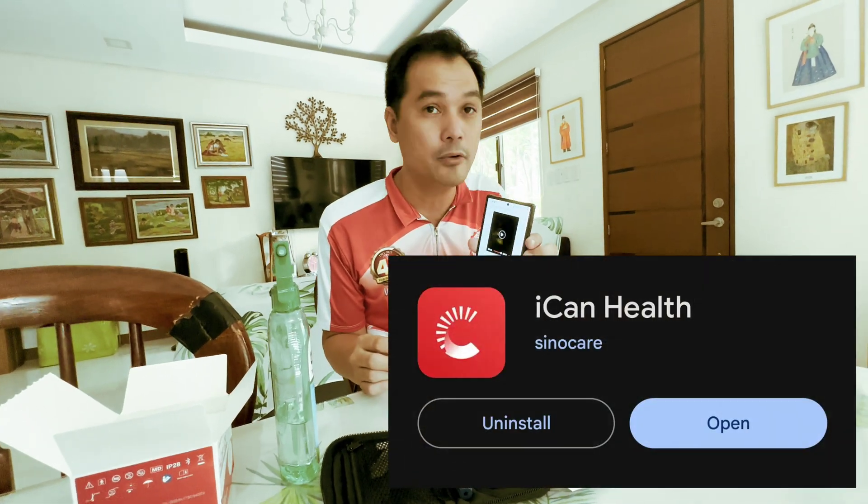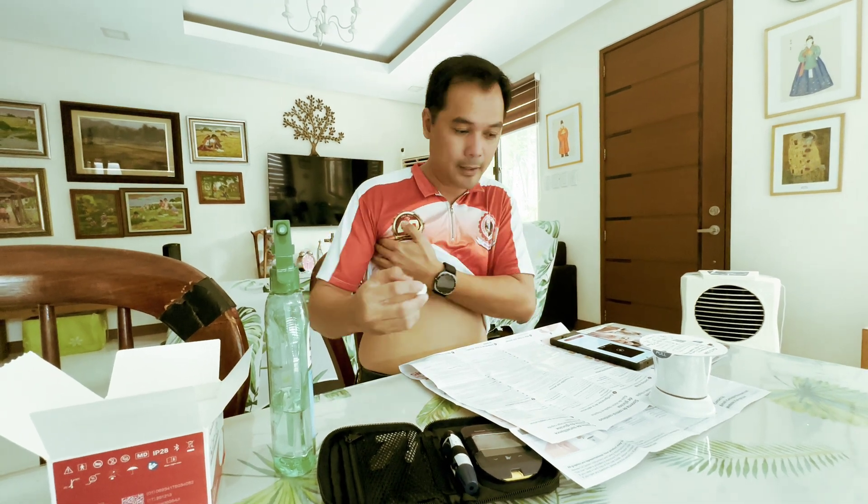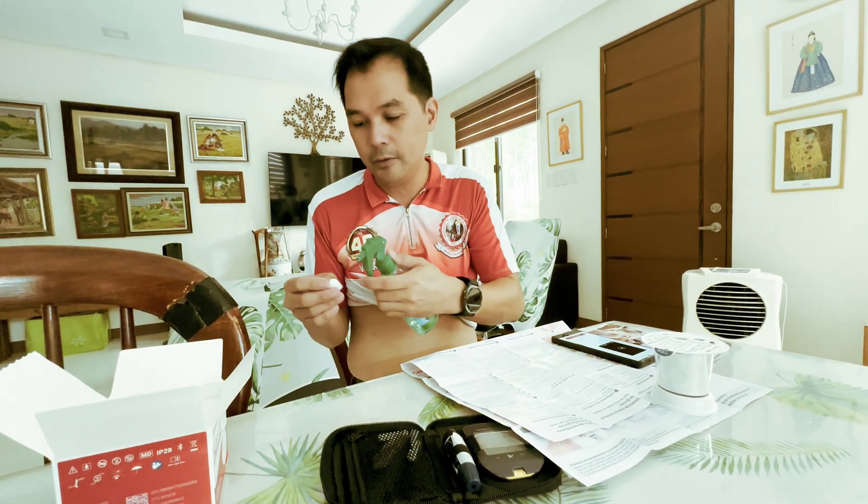Okay, this is our YouTube channel. I already installed the SinoCare app on my Android device, and there's a video tutorial on how to install and set up the sensor.